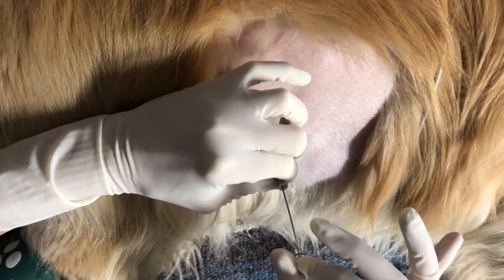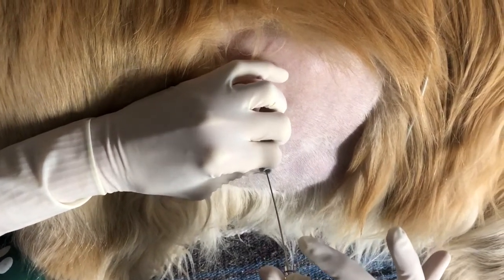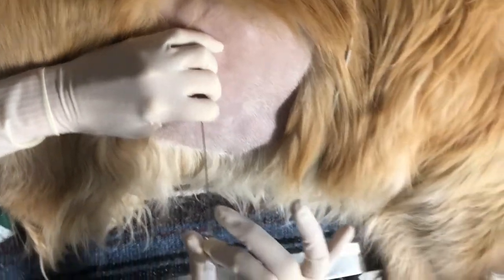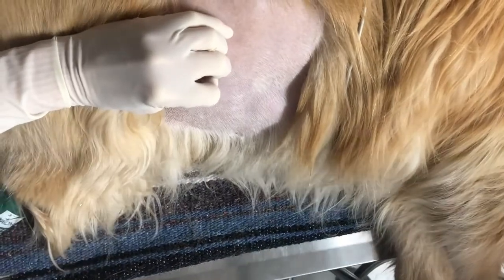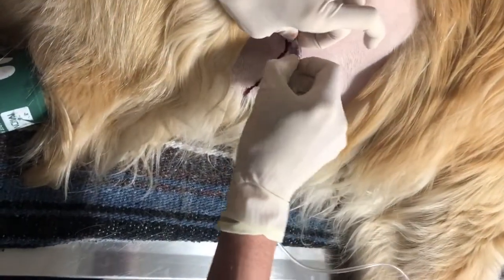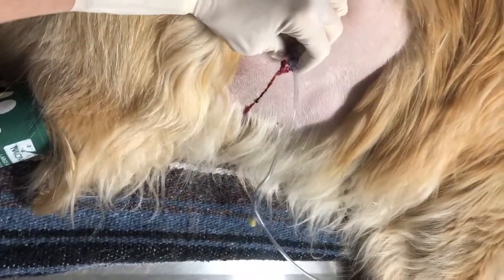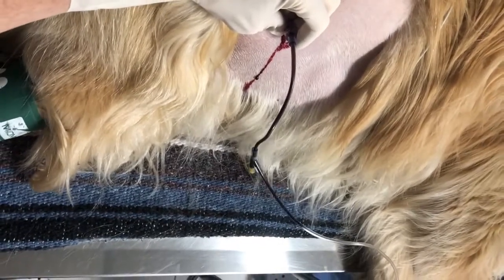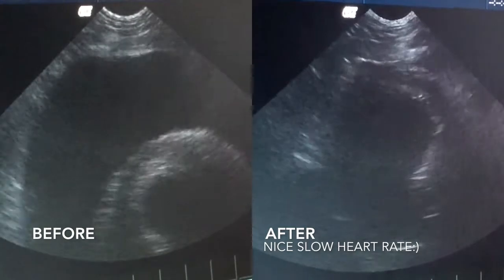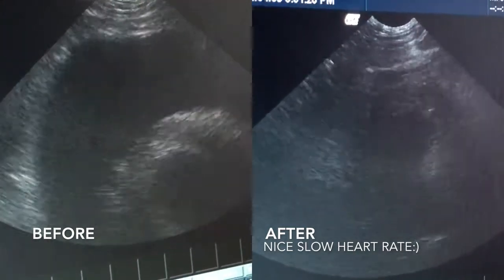As you're feeding the catheter, if you feel the tip come into contact with the heart, you can probably stop feeding there or even back off a little bit. Remove the stylet and temporarily occlude the hub of the catheter while you attach the extension set. Your assistant can begin to aspirate the fluid by drawing back on the syringe. Prepare your samples for fluid analysis and then continue draining the pericardial effusion. When you are done, remove the catheter and place a bio-occlusive dressing over the site, and monitor the pericardial space for recurrence of effusion over the next hour.